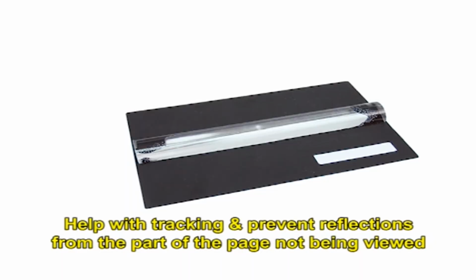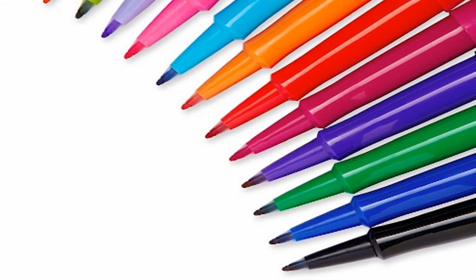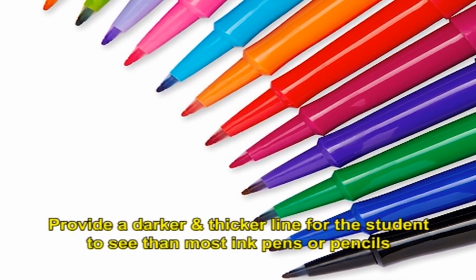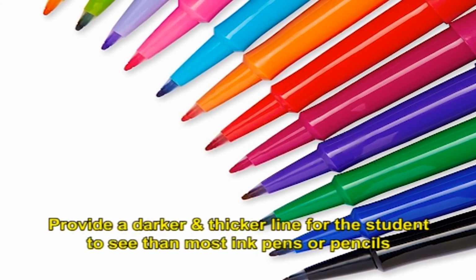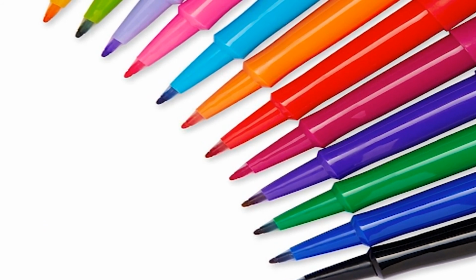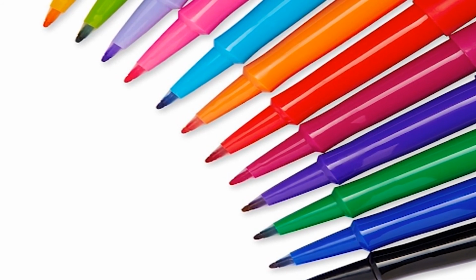Felt tipped pens. Felt tipped pens are helpful for writing activities because they provide a darker and thicker line for the student to see than most ink pens or pencils. A felt tip pen has a special point or fiber tip that provides bold, easy to read black ink.